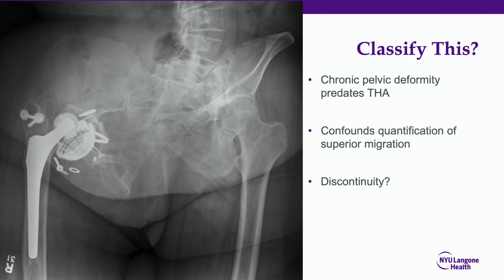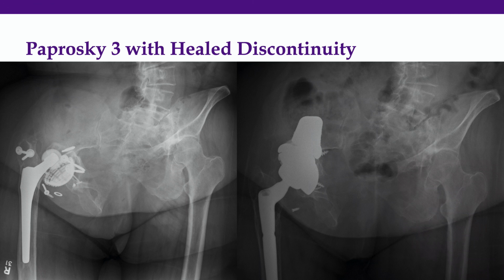So some defects don't perfectly line up. This is a patient who had a prior pelvic fracture before the hip replacement, and then obviously the hip failed. So if you look at the hip center, it doesn't look that elevated compared to the contralateral side until you realize how low the ischium is displaced on that side, and there was substantial bone loss here, and this required substantial augments superiorly to reconstruct, and so this is sort of a 3A kind of defect.